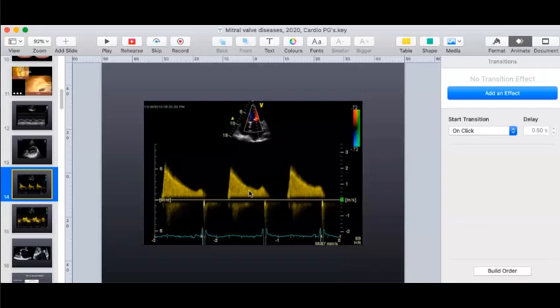So you can get an erroneous reading of the mitral valve area. So that is one area where you have to be careful in terms of an AR which is more than moderate, which can affect the mitral valve area calculated by pressure half time. Now, when you look at mitral regurgitation, the flow across the mitral valve goes from here and goes across. So your gradients will increase. It will affect more of the gradients, but it will not affect your mitral valve area. So that is something you have to keep in mind. So you have gradients, which will be affected by MR, and you have aortic regurgitation, which will affect the pressure half time calculation for mitral valve area.